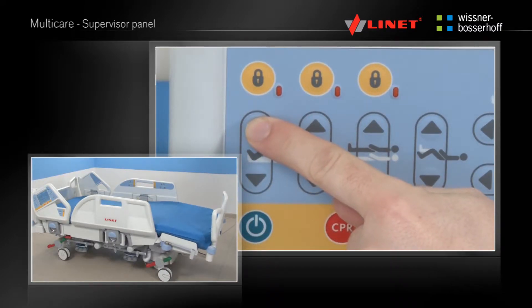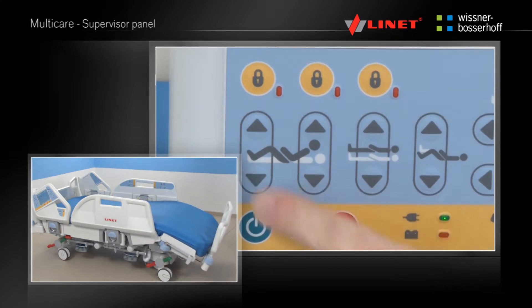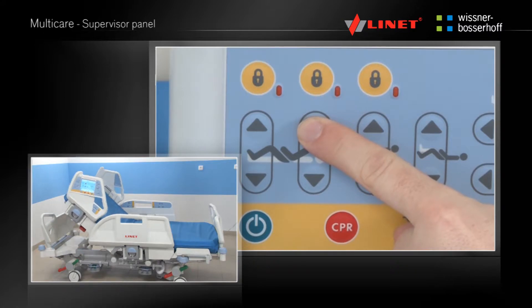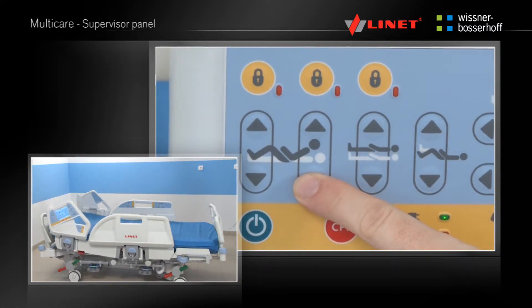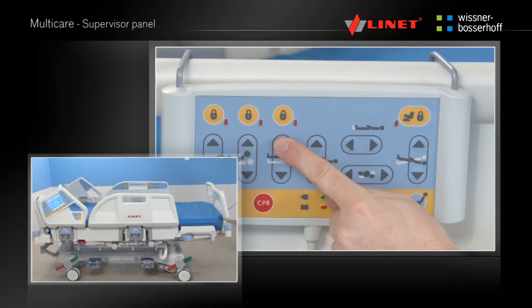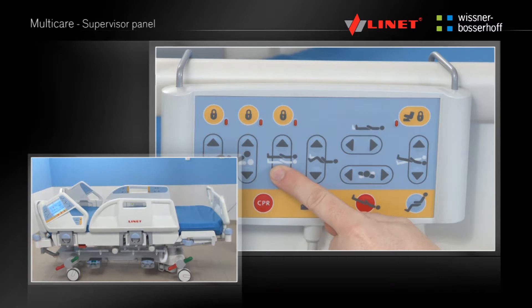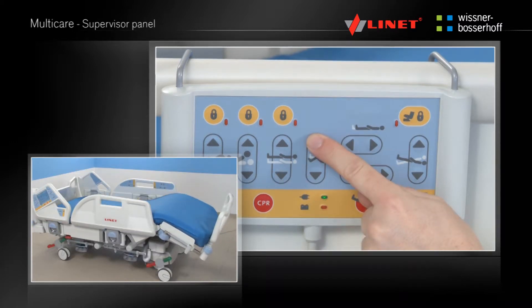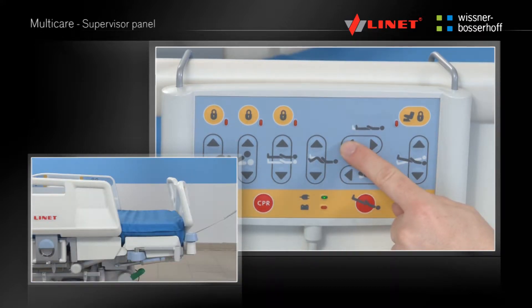The supervisor panel provides the user with the thigh rest, back rest and calf rest positioning. It also provides the mattress platform extension button.